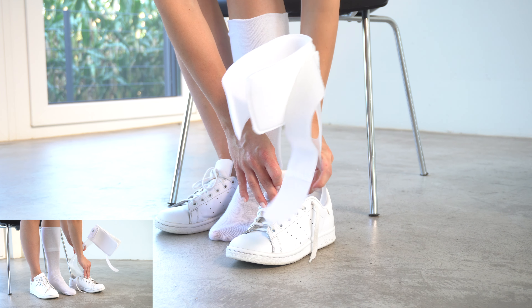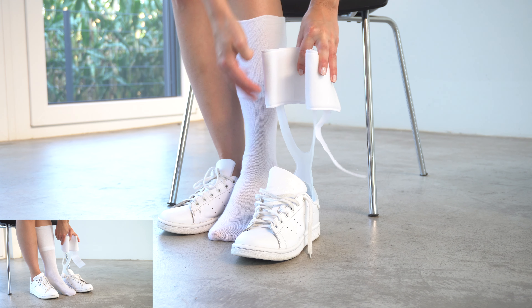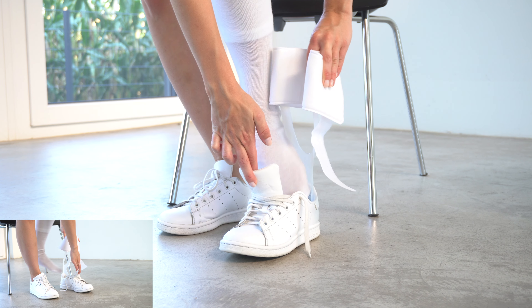The orthosis can only be worn in combination with a shoe. Position the orthosis in the shoe and put it on together with the orthosis.